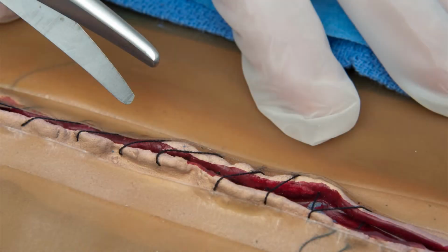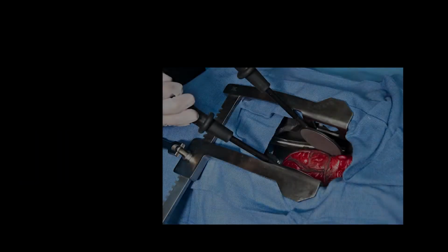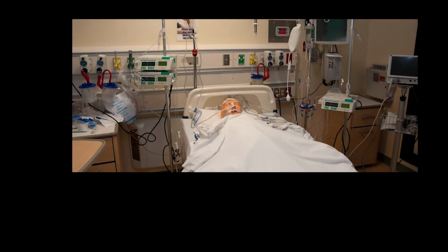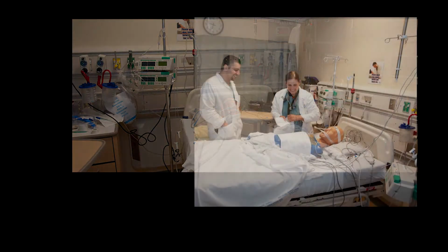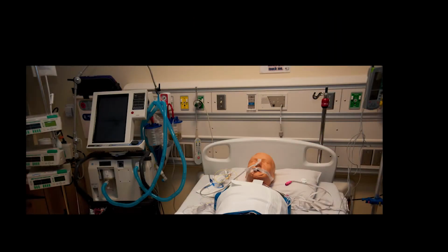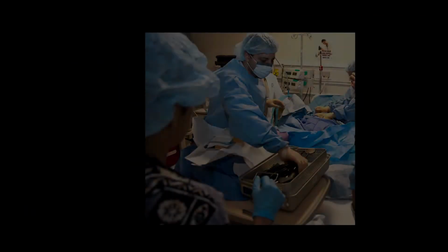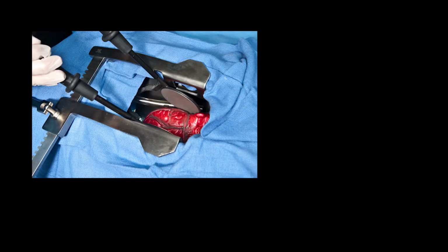The CPR mannequin was able to have its chest opened by cutting the suture of the chest incision, removing the sternal wires, and placing a retractor to reveal the heart, all in order to perform internal heart massage and defibrillation. Key to success of the simulation went beyond just the mannequin. The simulations were conducted in an empty ICU patient room with as much of the usual post-open heart equipment as possible. This included pacemaker box, ventilator, chest tubes, IVs, and internal defibrillator paddles.